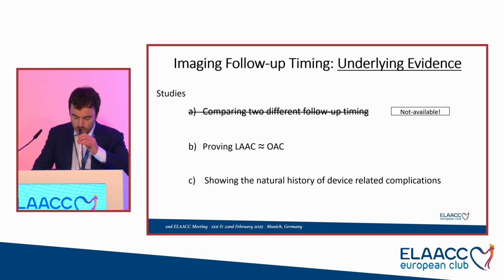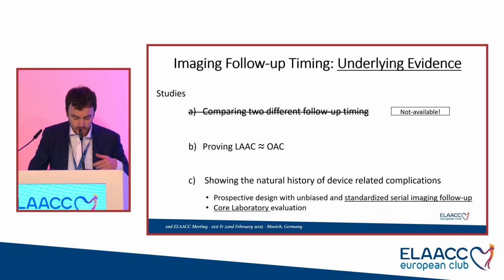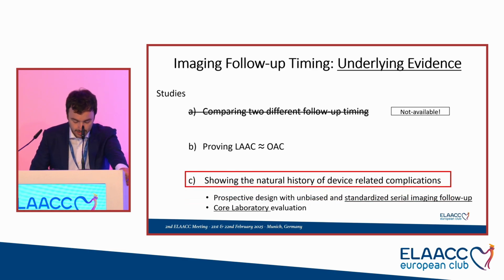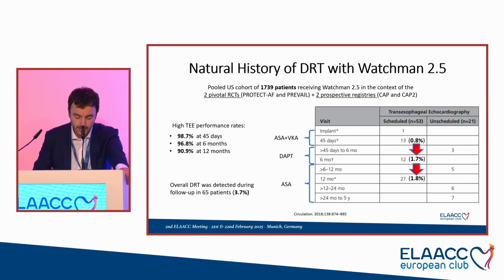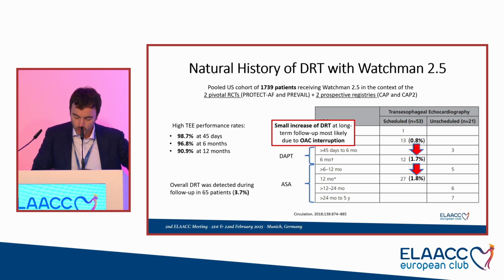Then we have the studies that show the natural history of the device-related complications, and we should consider the prospective studies with standardized imaging follow-up and with central core laboratory evaluation. Regarding the device-related thrombus, we look at the Watchman 2.5 population.